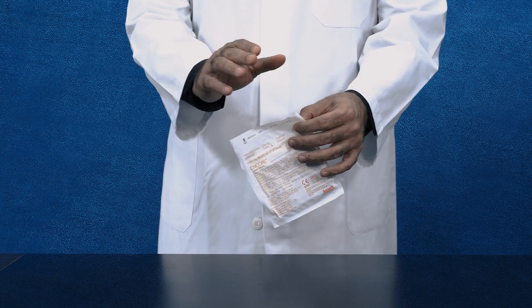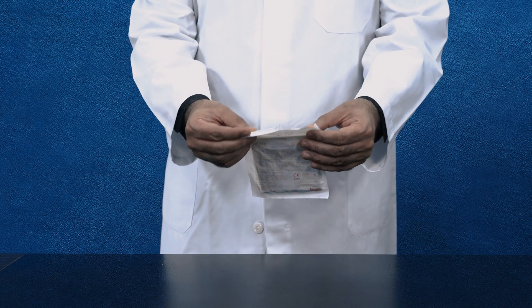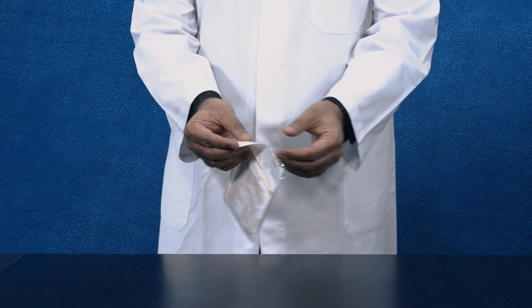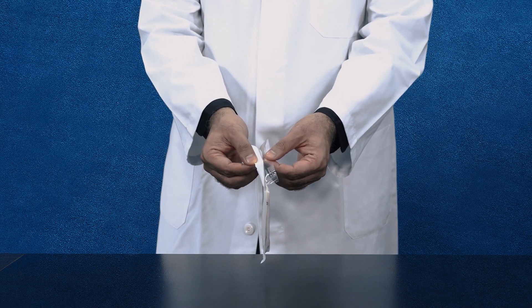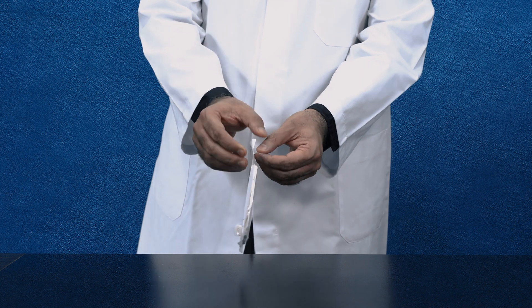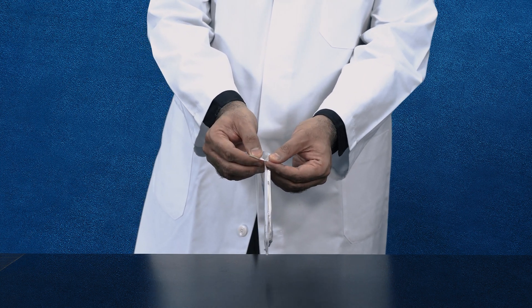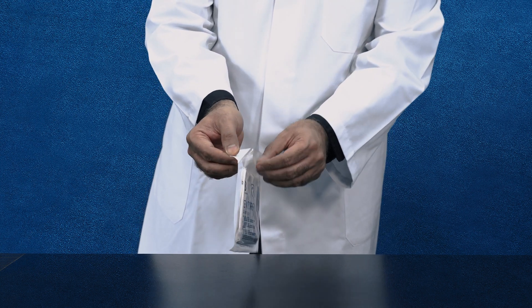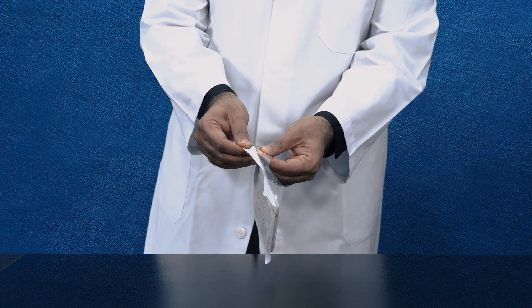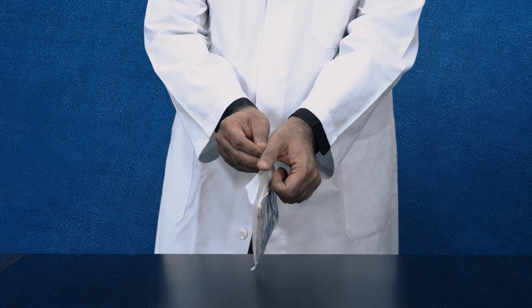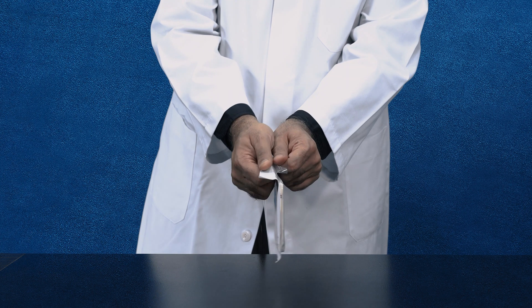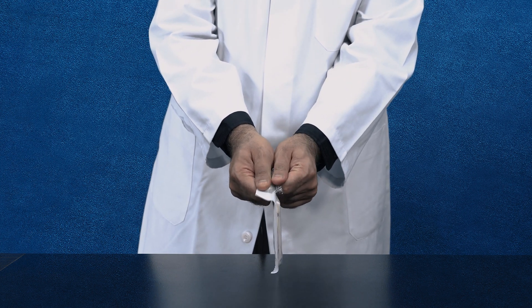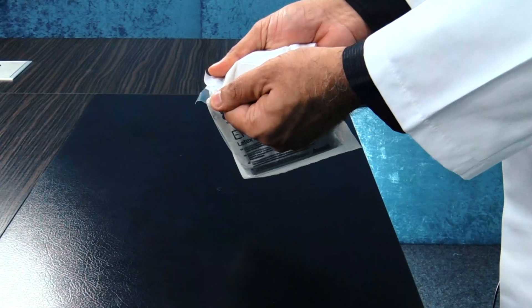Every peel pack is the same. There are two flaps. Majority of the people open from the center - never do that. Open from one edge, a little bit from the other one, place your thumbs, keep pushing and opening it up.